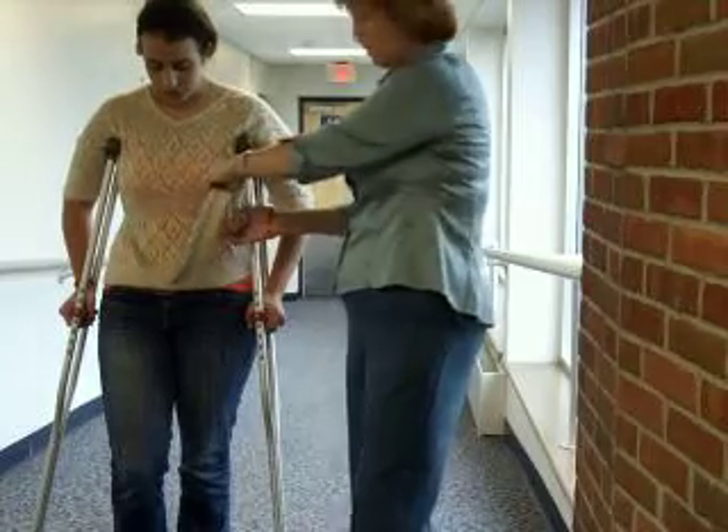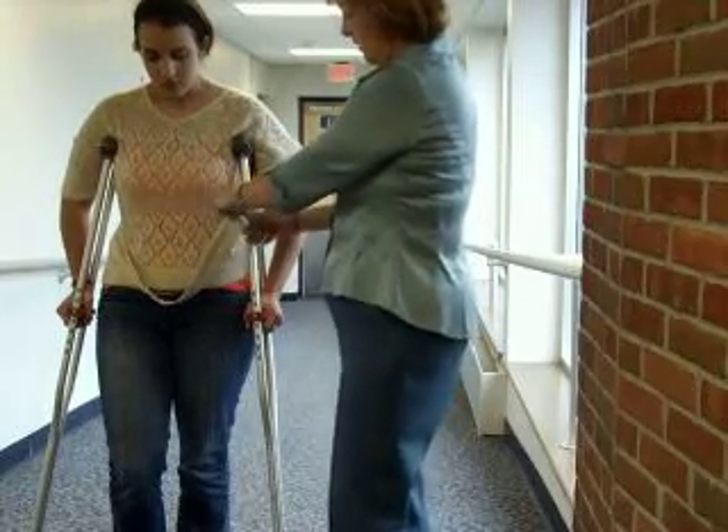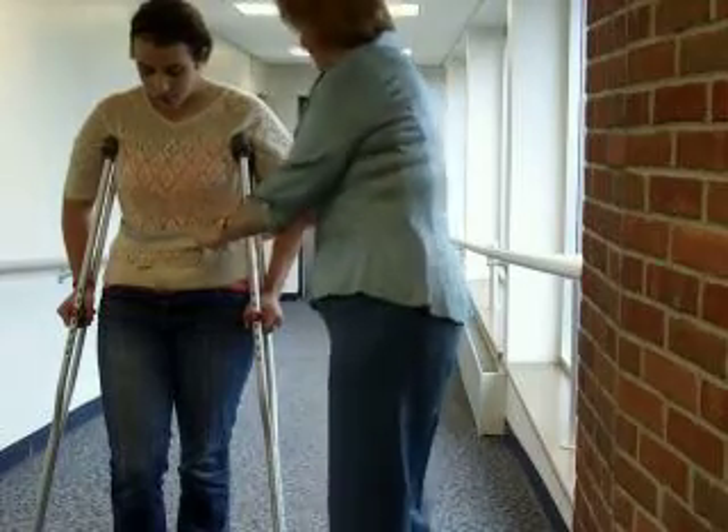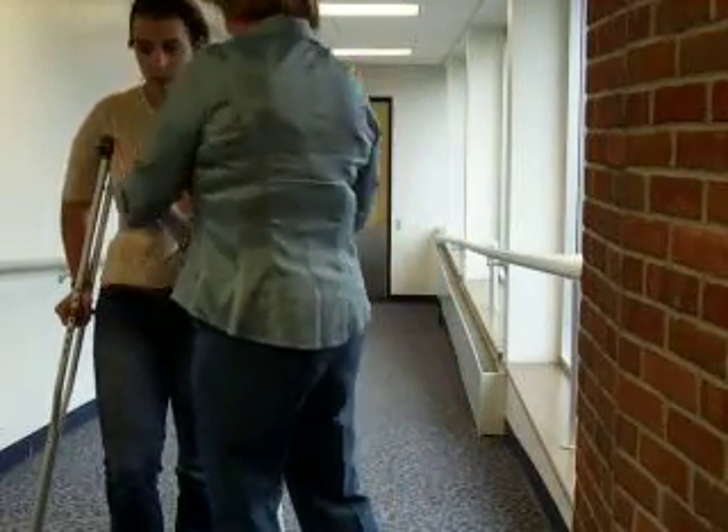As always, I'm going to put the gait belt so it's around the waist, kind of between where the ribs end and where the pelvis is. Is it uncomfortable at all?